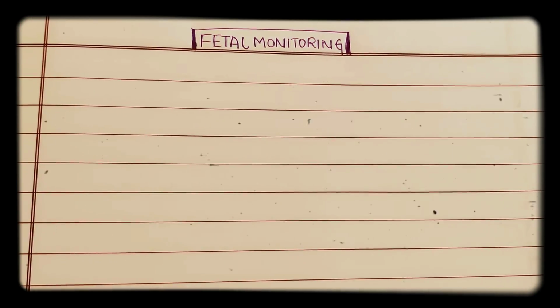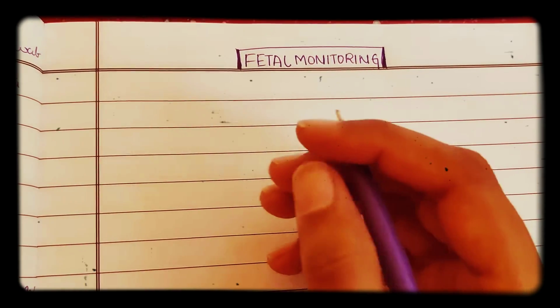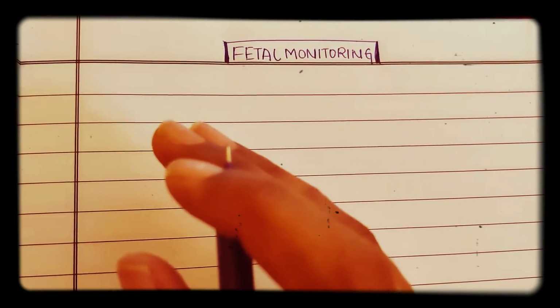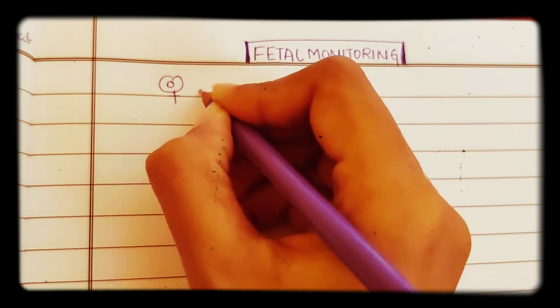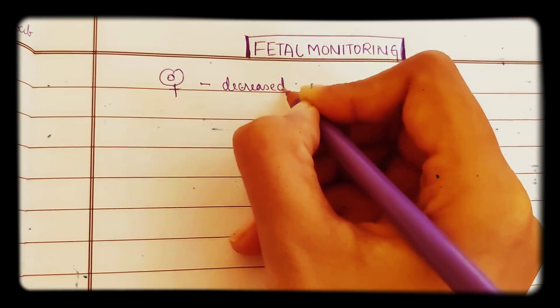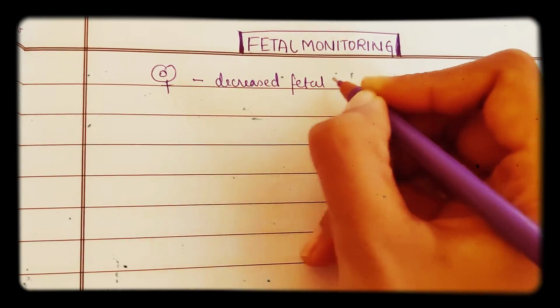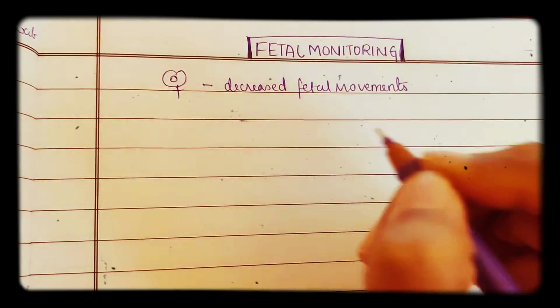In this video we are going to discuss fetal monitoring. So what is a screening test? This fetal monitoring we do only in the case of a pregnant female who is having decreased fetal movements. So if any pregnant female is having decreased fetal movements, then only we will do fetal monitoring.